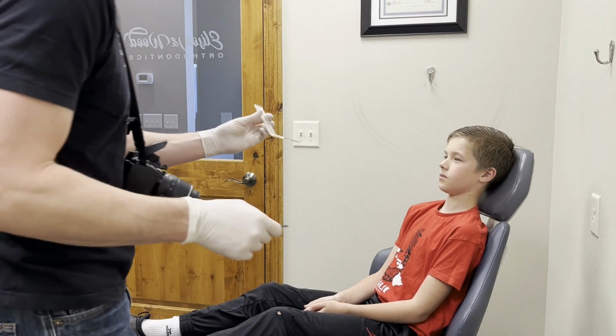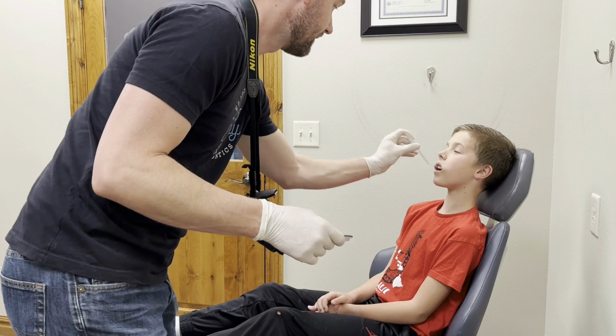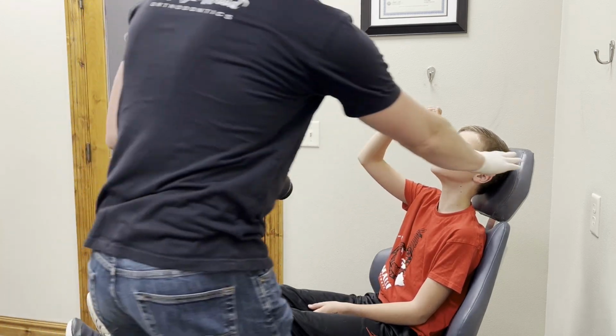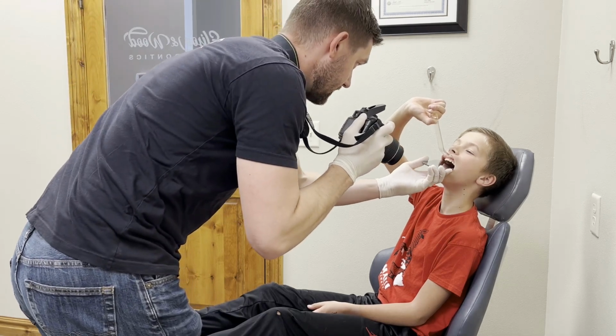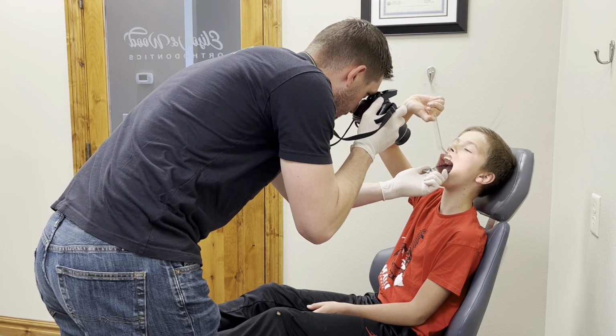So first we're going to put this on, go ahead and open big. This will just slide right in here like this. And then go ahead and hold on way up here for me. Just hold it way up high like that. Rest your head back against here, turn toward me. There you go, raise that really big. And then open as wide as you can. I'm just going to slide this in here and open as wide, wide, wide as you can. Big, big, big.